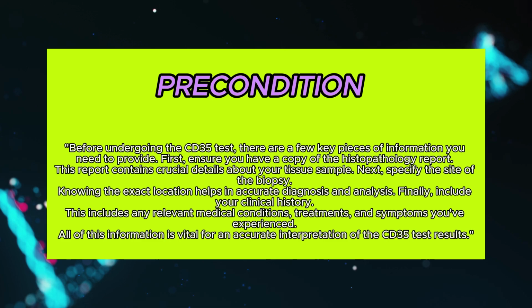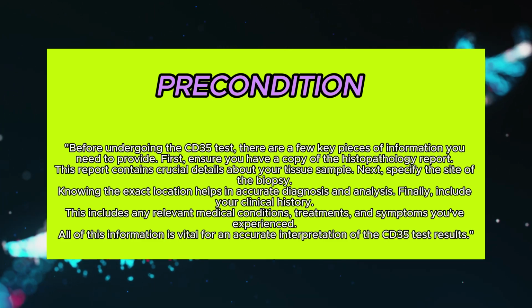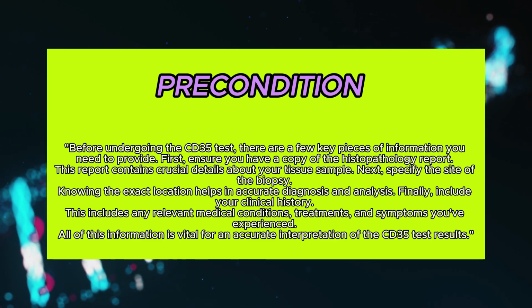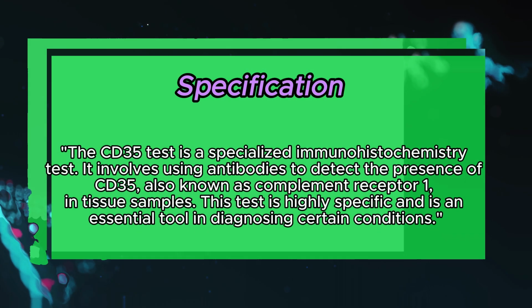Finally, include your clinical history. This includes any relevant medical conditions, treatments, and symptoms you've experienced. All of this information is vital for an accurate interpretation of the CD35 test results.